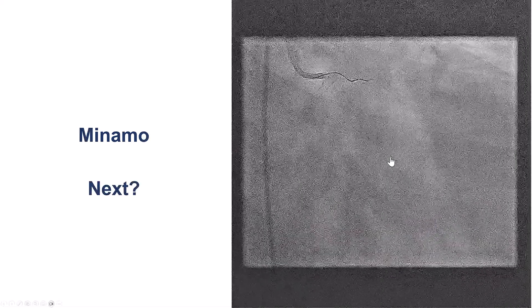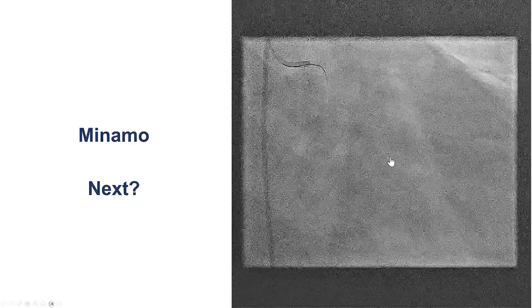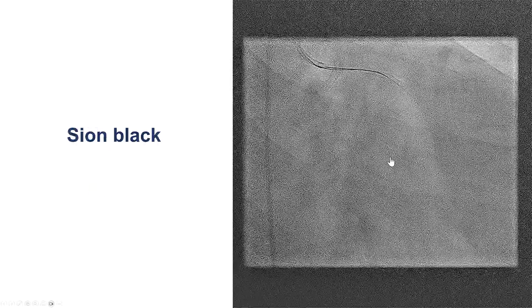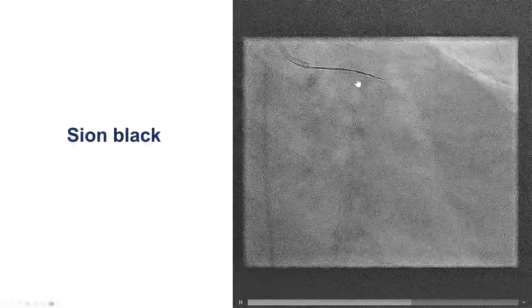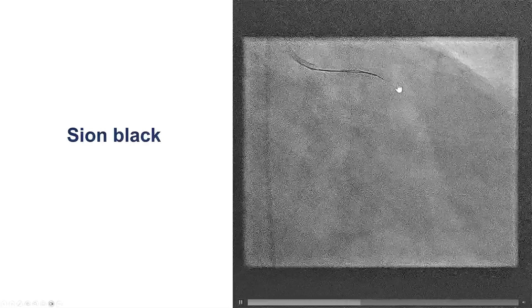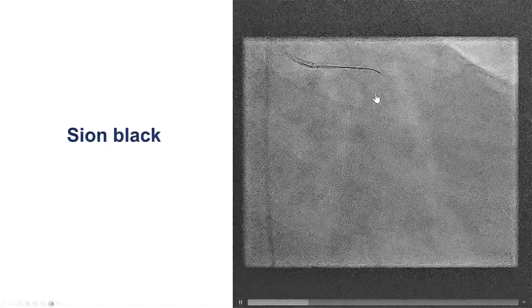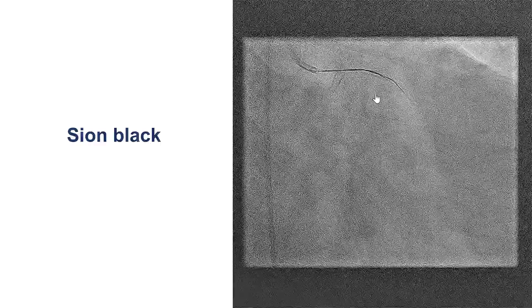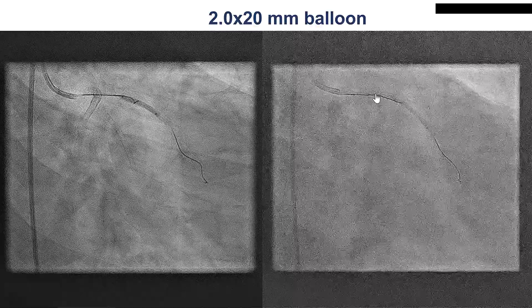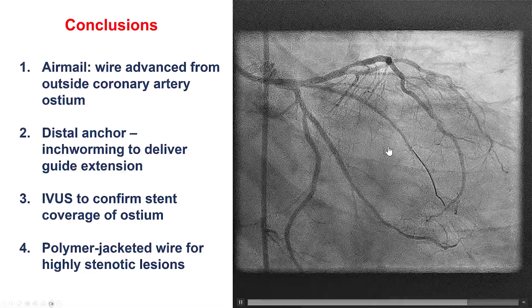We then decided to treat the obtuse marginal, but we were unable to wire through the lesion, which was highly stenotic, with a standard workhorse guide wire. So, what to do next? We used a Sion Black, which is a soft, non-tapered, polymer-jacketed wire, and with mild rotation we were able to get it through the lesion. Lesions that are highly stenotic can sometimes be more easily crossed using a polymer-jacketed wire. Given the small size of the vessel, we decided to do just ballooning with a 2.0mm balloon, which provided a nice result in the Ramus as well.